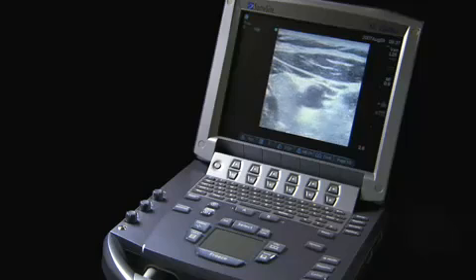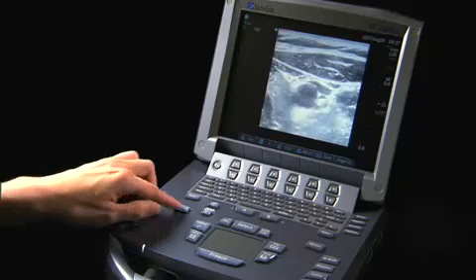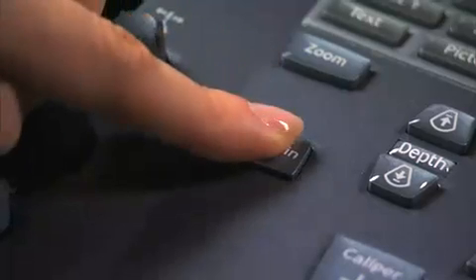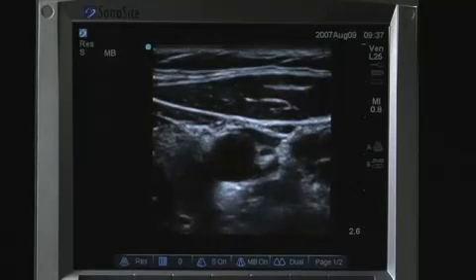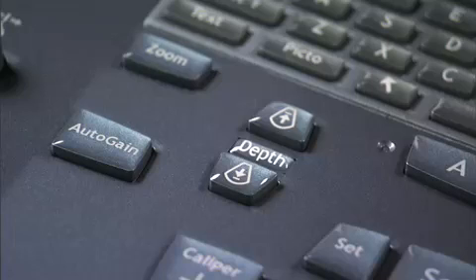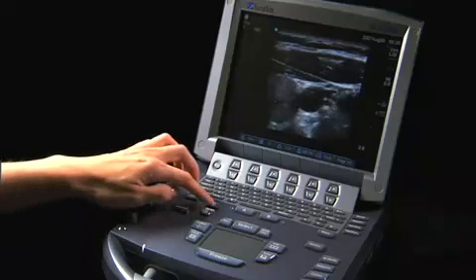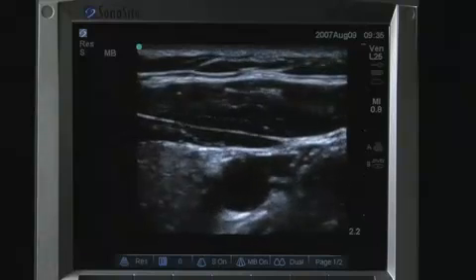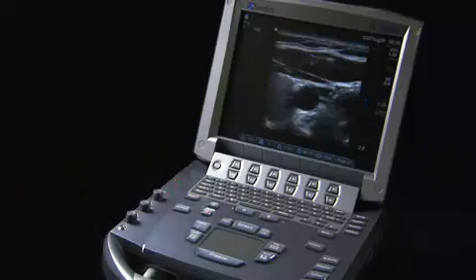The system can automatically adjust the 2D gain levels to the optimal level. Select Auto-gain to activate this feature instead of using the manual gain controls. There are two keys for adjustment of imaging depth: Depth Up decreases imaging depth, and Depth Down increases imaging depth.